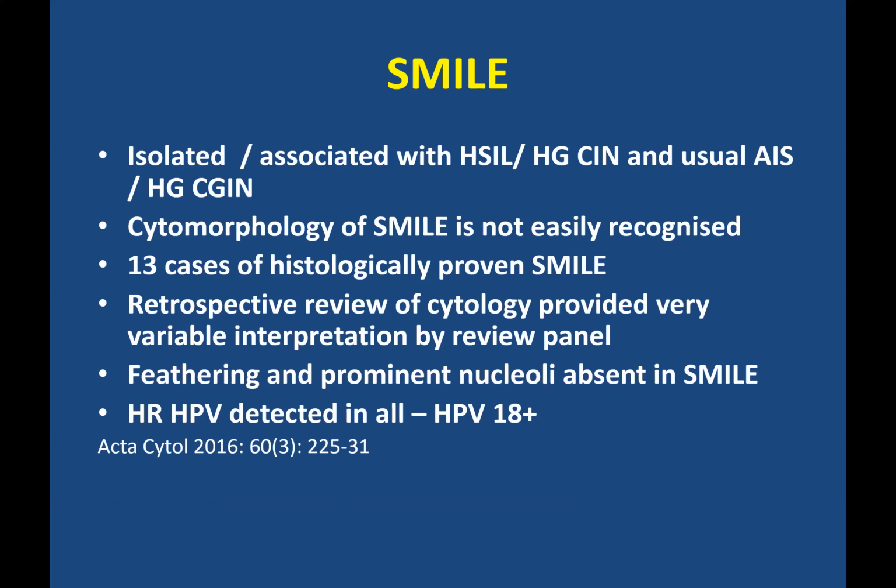I just want to touch upon SMILE, stratified mucinous intraepithelial lesion. It can be isolated, or it can be associated with high-grade CGIN and HSIL as well, or high-grade CIN. The cytomorphology of SMILE is not easily recognized.